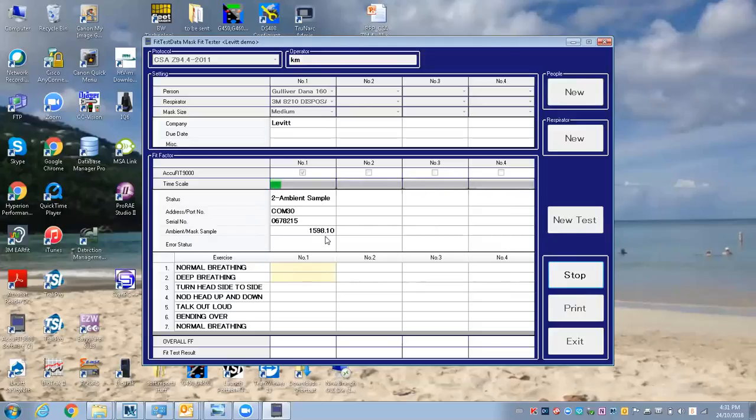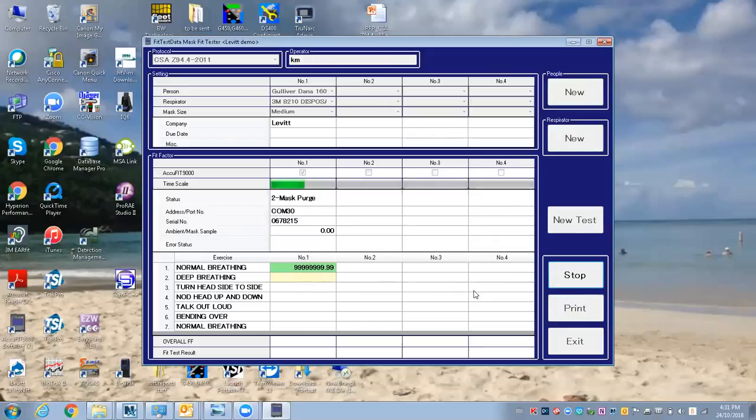You want to take the respirator off, stop the fit test basically, and readjust the mask. You can see we have a really huge fit factor because I still have the HEPA filter hooked up.